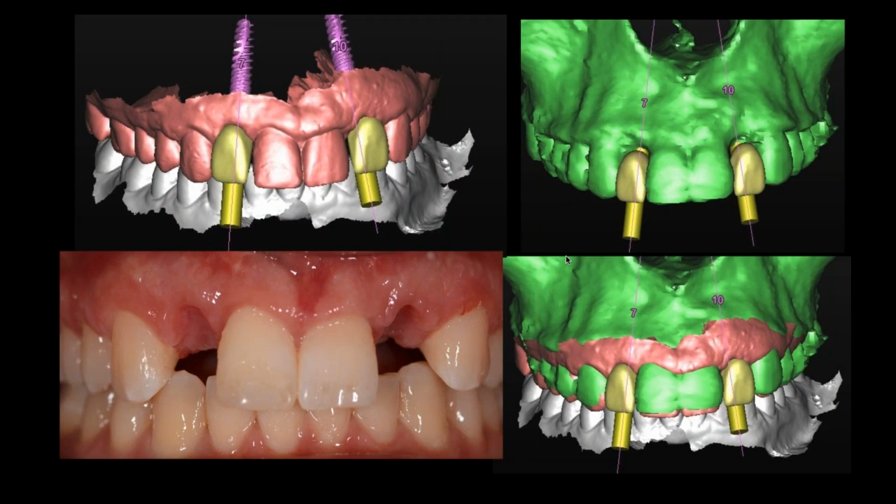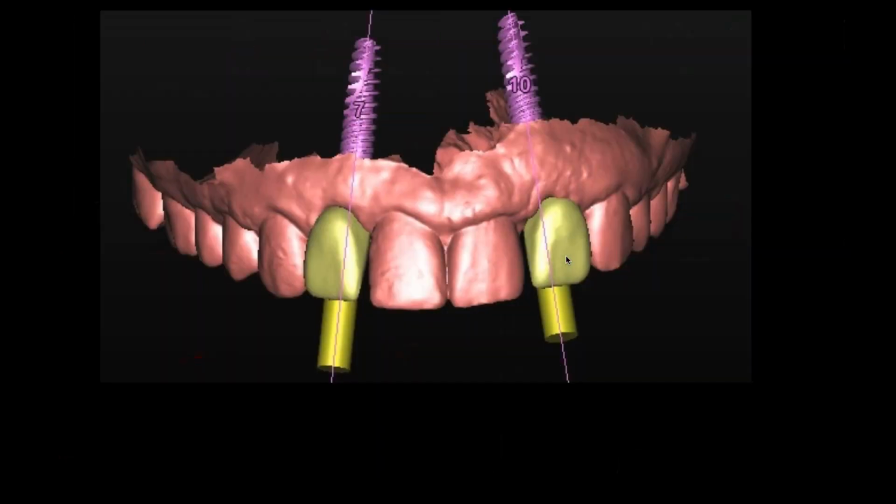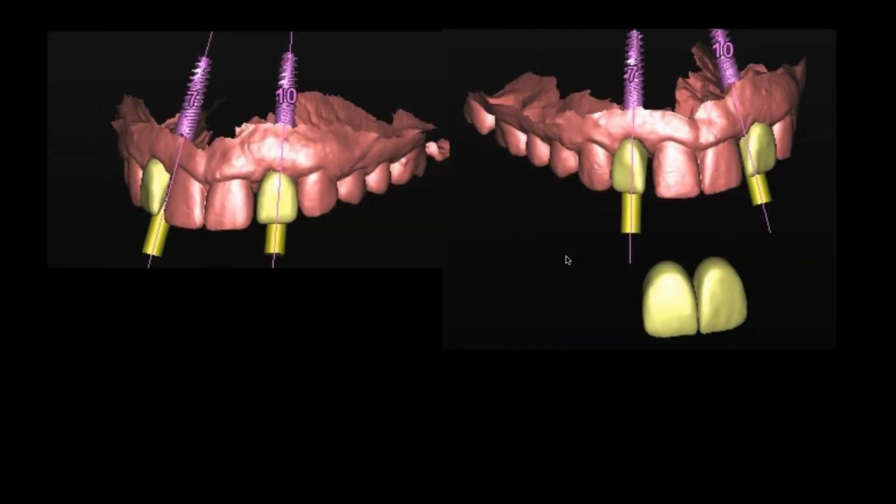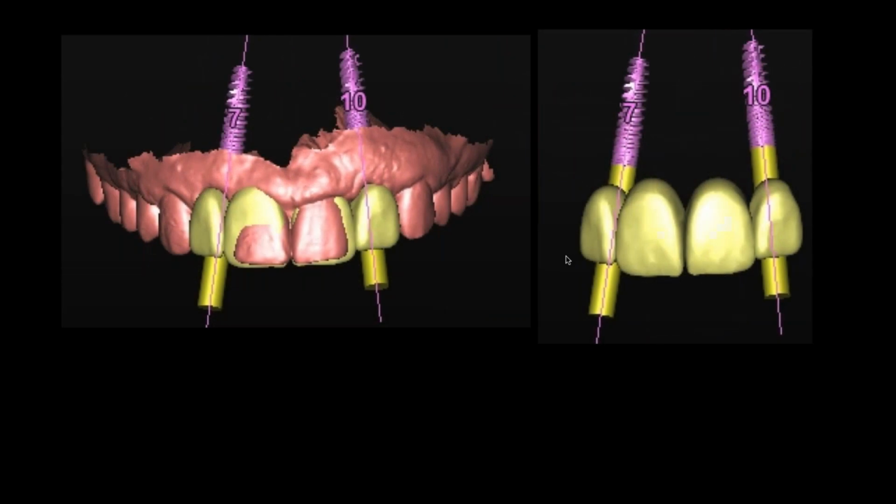So what do I do then? Well, I take this image and you can see on the right side the smudging from the CT scan, which is why I have the setup in there. And so now I'm ready to go. So I take what she has now, and I'm saying I'm going to make this even prettier. I put some virtual centrals in there. So I take some central incisors, virtual teeth, I put them right in position, size them, shape them so that they're proportional.